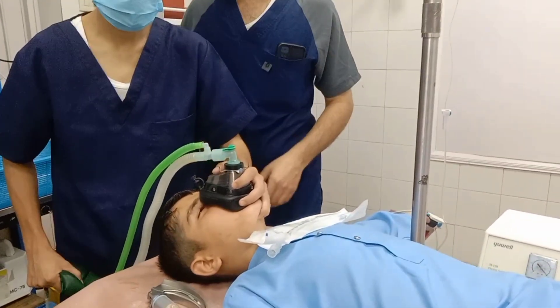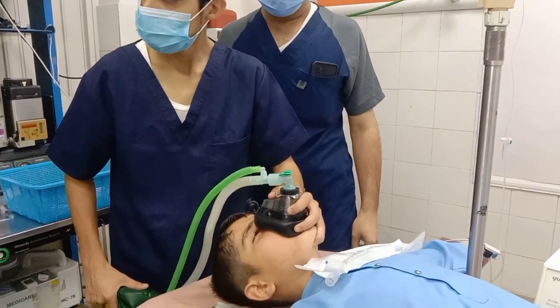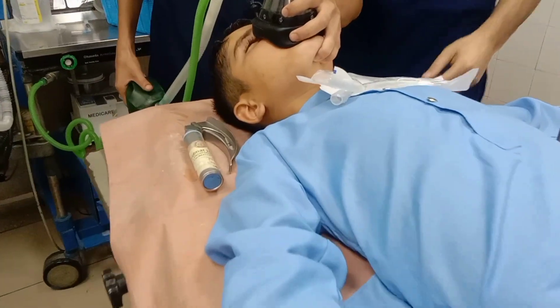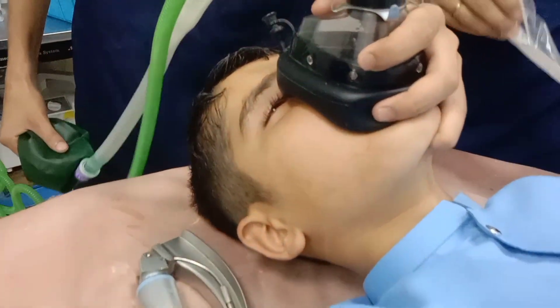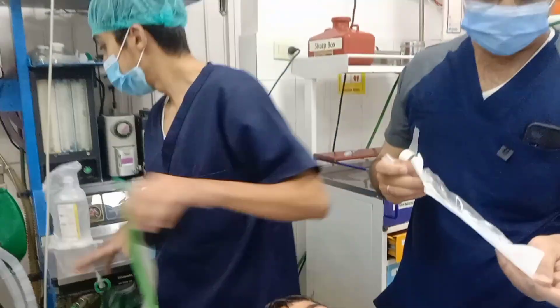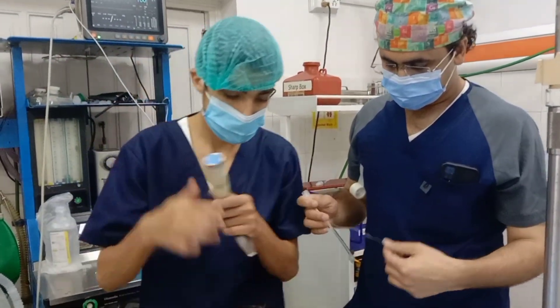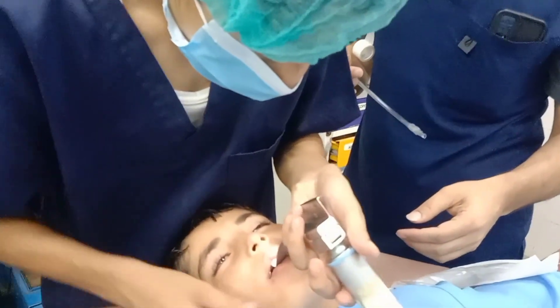The patient was then connected to the anesthesia circuit and mechanical ventilation was initiated. Oxygen saturation, heart rate, blood pressure, and other parameters were continuously monitored throughout the process to ensure patient safety and stability.